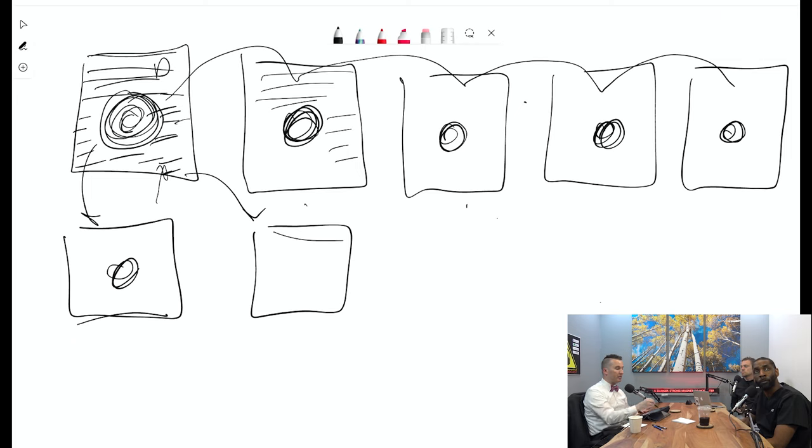Same thing, we're copying and pasting the periphery, and so this has a temporal footprint of however long our sequence went on. A minute and a half is its temporal footprint. Make sense? So that's where with keyhole filling you've got to be really aware of that. Now, typically, there we go.